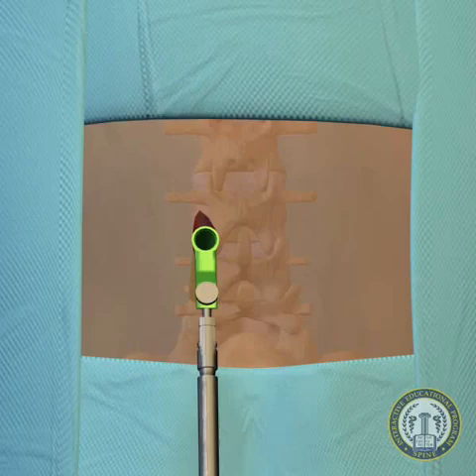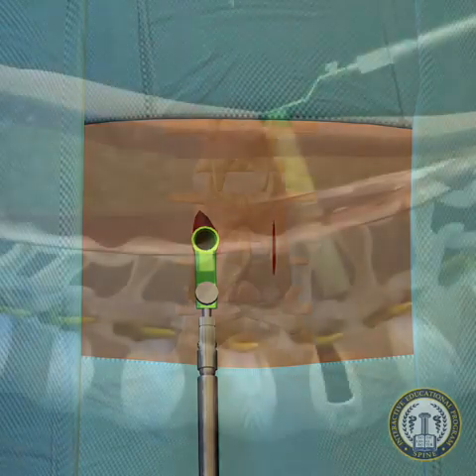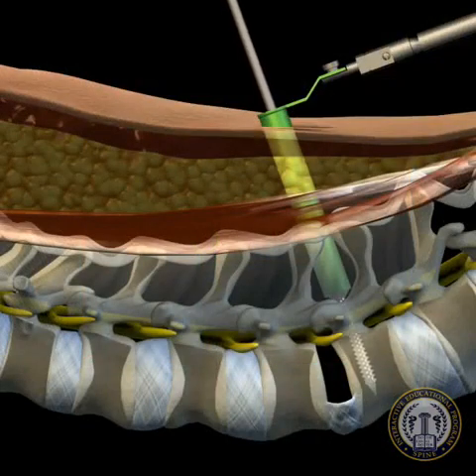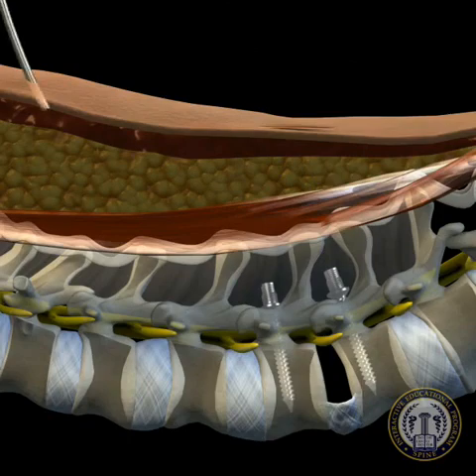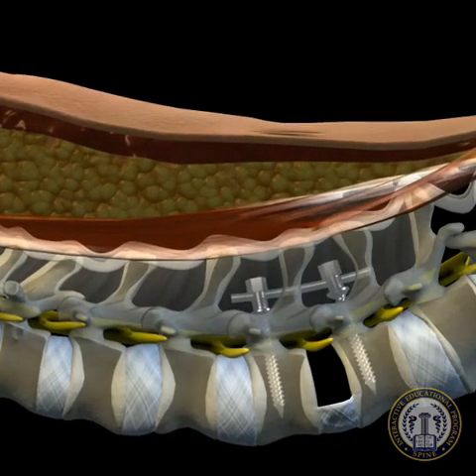Following the discectomy, the interbody space may now be distracted by creating a mirror 2.5 centimeter skin incision on the contralateral side, centered over the interbody space. Percutaneous pedicle screws are then placed, and a rod is subfascially levered into place. The contralateral screws are tightened to a distracted position in order to create optimal space for the interbody device.